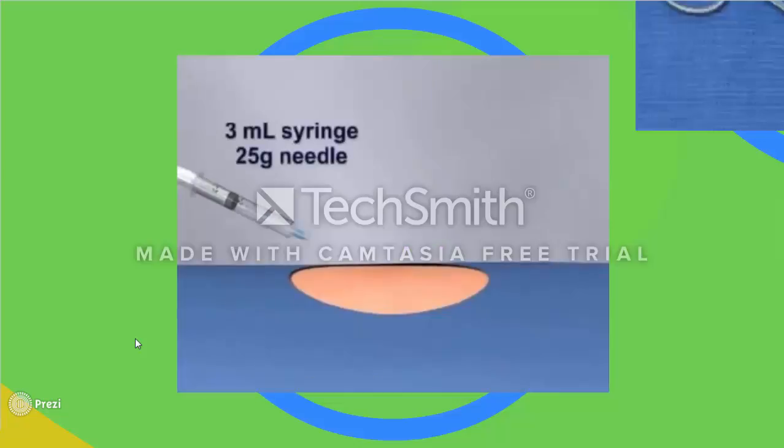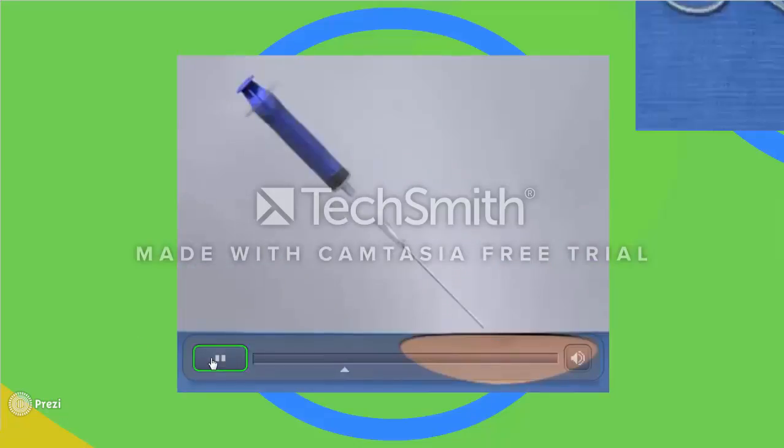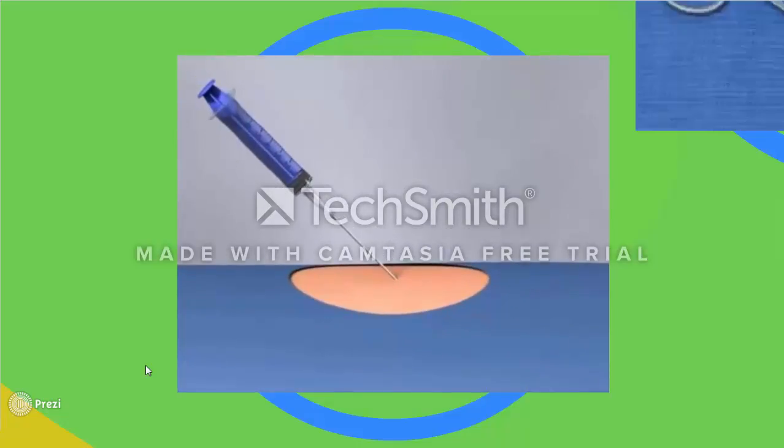Use the 3 milliliter syringe and the 25 gauge 1-inch needle to place a wheal of anesthetic in the skin. Switch to the 22 gauge 1 1/2 inch needle to place anesthetic into the deeper tissues. Next, attach a 5 milliliter syringe to the 18 gauge 2 1/2 inch introducer needle and advance toward the vessel. Pull back on the plunger as you proceed. Blood will fill the syringe when the vessel is entered.